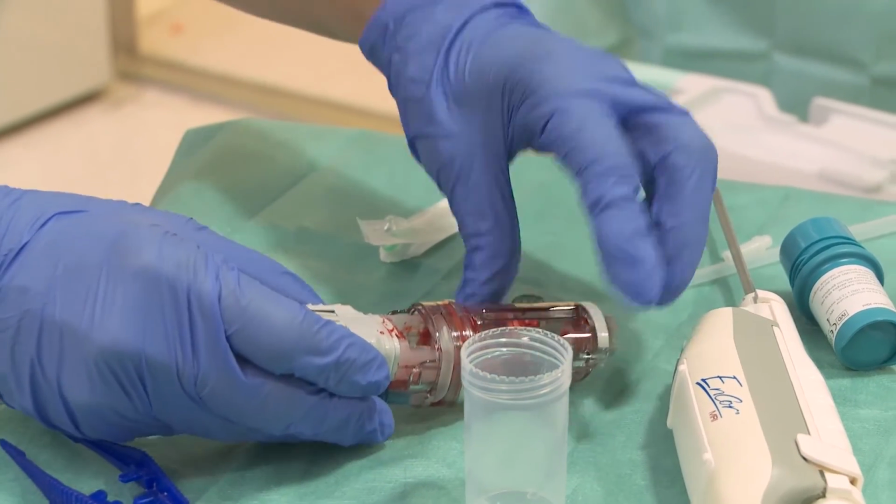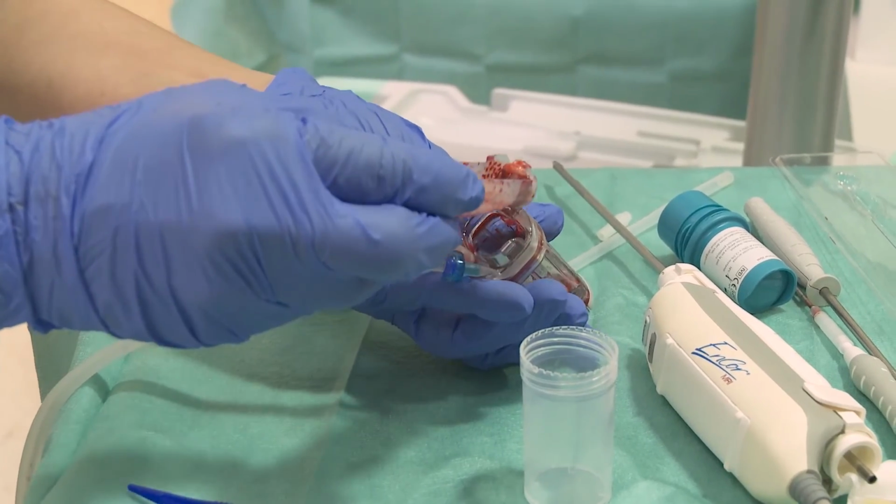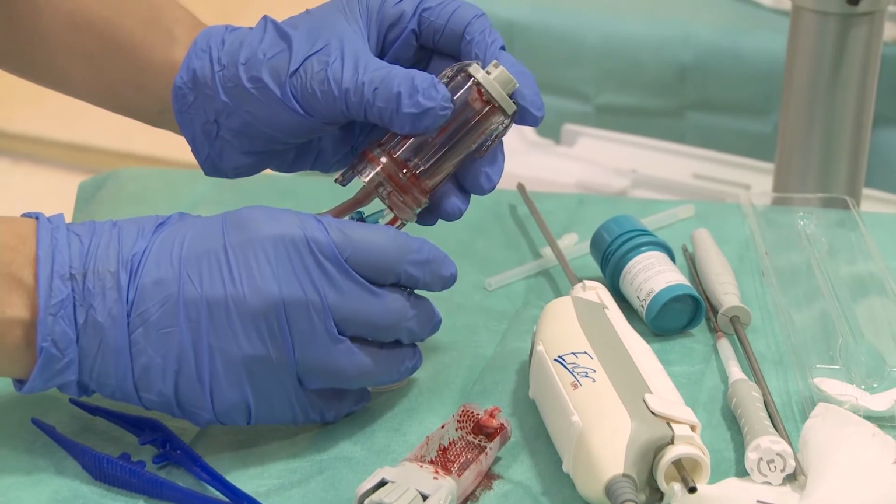While patient care actions are in progress, samples are carefully deposited in the dedicated container.